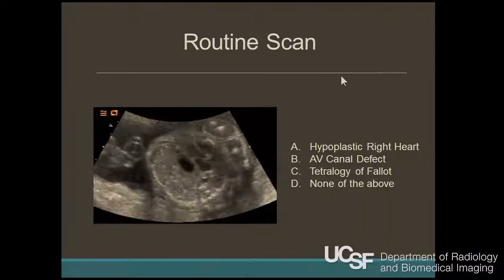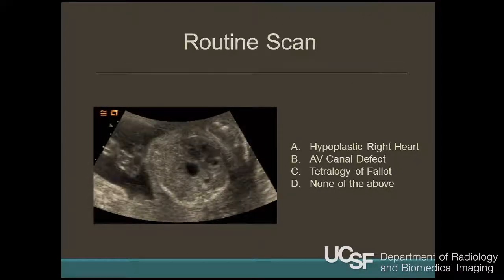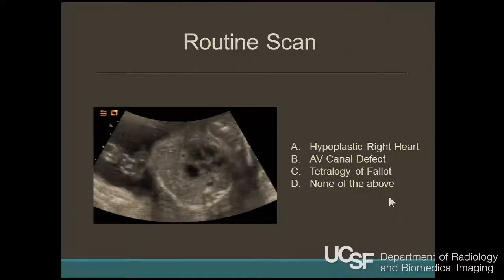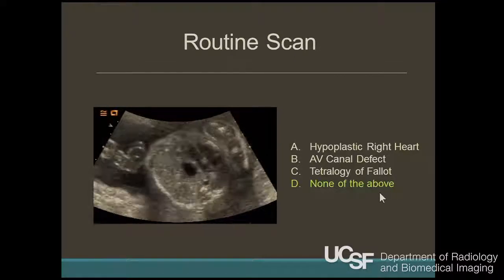So back to the fetus again. So a cine clip showing the heart with a couple of choices here. Figure out what you think it might be. And again, this is none of the above.